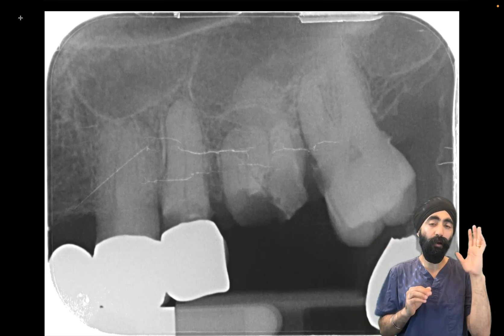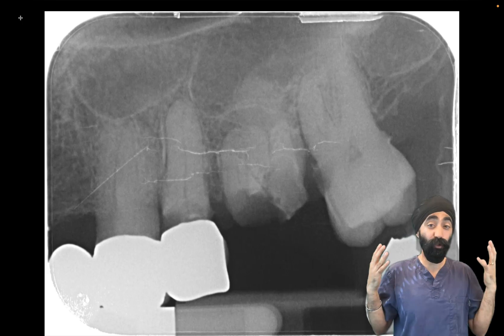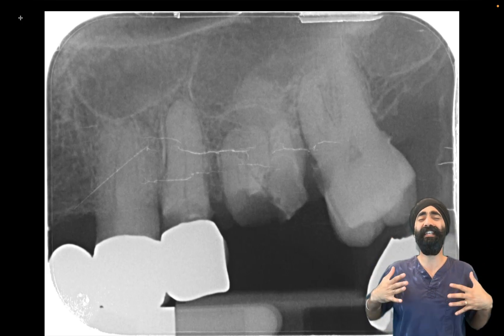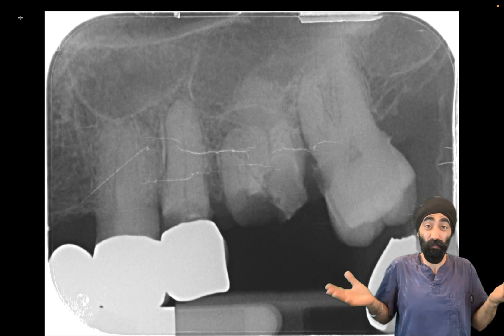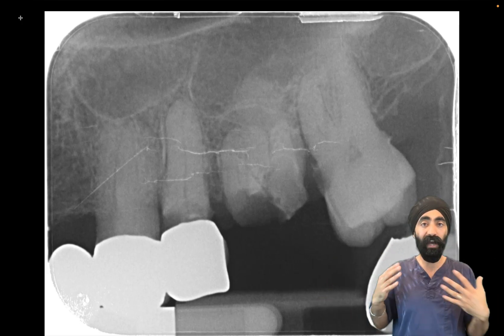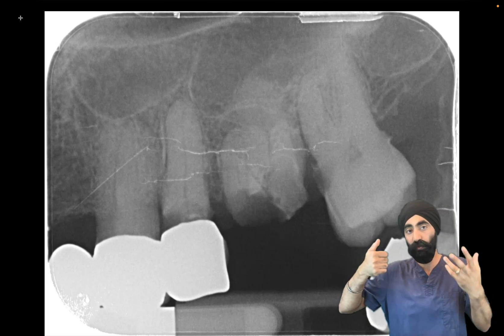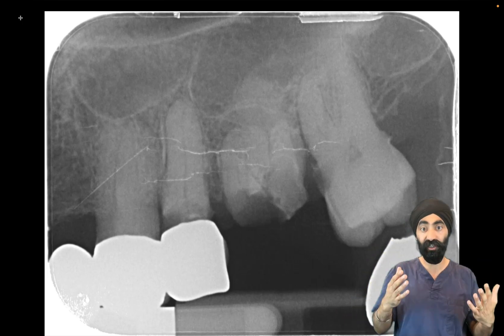In this video, I'm going to show you how I extracted this upper left first molar through sectioning and elevating. I'm hugely biased towards sectioning — I think it's a great skill to have as a dentist. It makes my extractions more predictable. I could have potentially removed it without sectioning, but I just think it'd be too much work to try and get some forceps on this tooth or just purely luxation. It's not so easy in my hands; I find sectioning much easier.